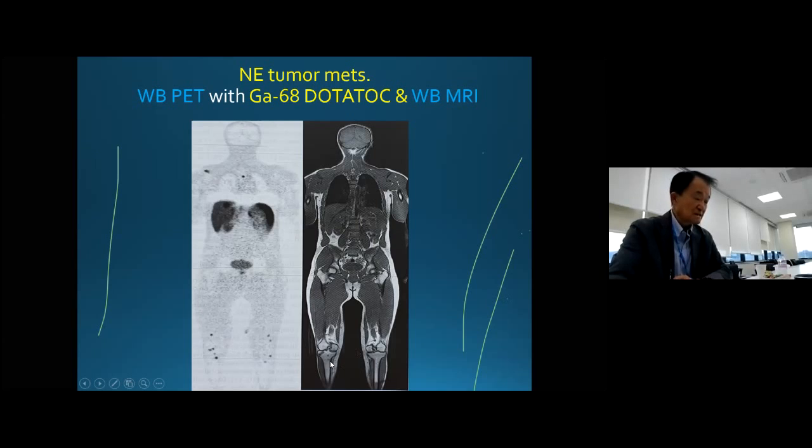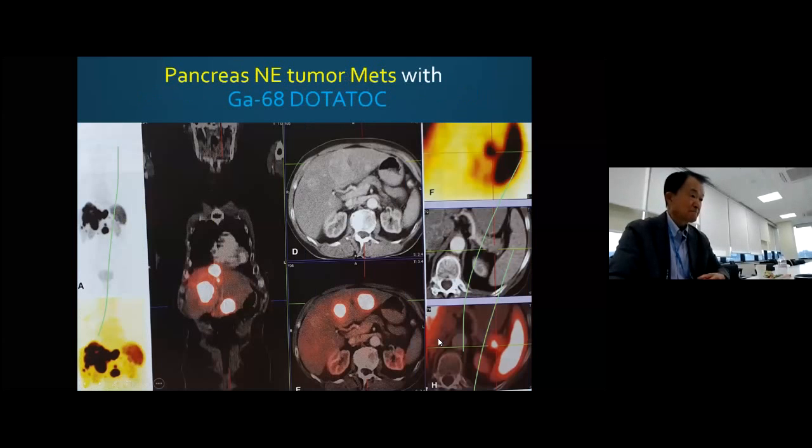You can't tell whether this is a tumor, like a leukemia, or other things, or red cell hyperplasia. When the patient becomes anemic, the bone marrow tries to make more cells, so the red cells become hyperplastic, and that causes just this, like on T1 it shows rounded spots. So it's not easy, not specific.